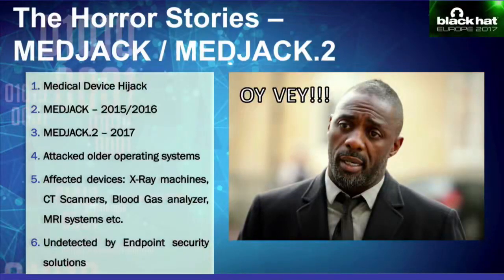MedJack 2 was a more sophisticated, evolved version, and most of you would have heard about it. Interestingly, MedJack only targeted older operating systems like Windows XP, Windows 2K, Windows 2K3, and it tried to exploit older vulnerabilities, like MS08-067, which was released in 2008.